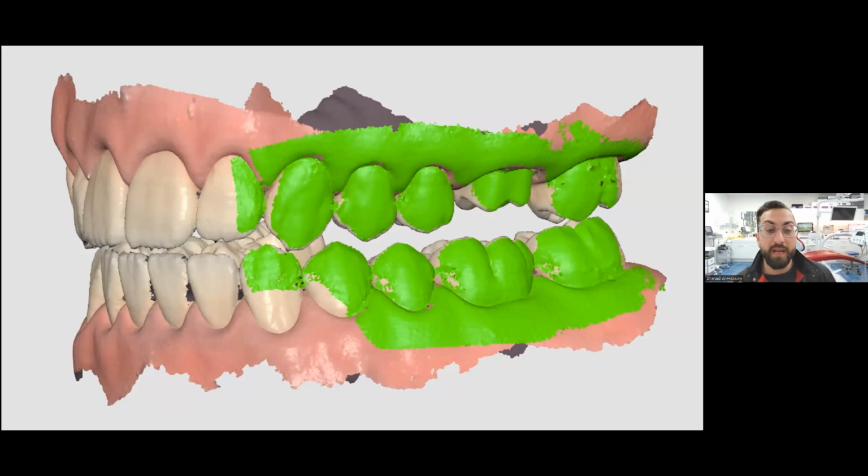And what I mean by correctly is nice and hard on their back teeth, and you check that. Before you take a bite scan, it's not a bad idea to retract the cheeks with a mirror and look down the buccal corridor to see they're biting properly. Now, I know there's two schools of thought about taking a bite scan. Some people say, tell a patient to open, move the scanner into the patient's cheek area, and then get them to bite and then scan.